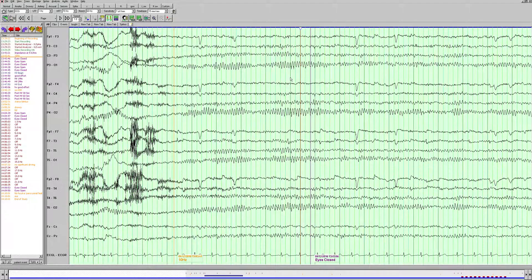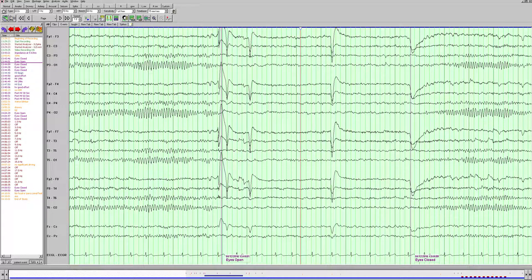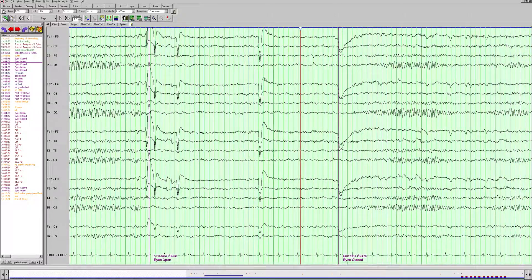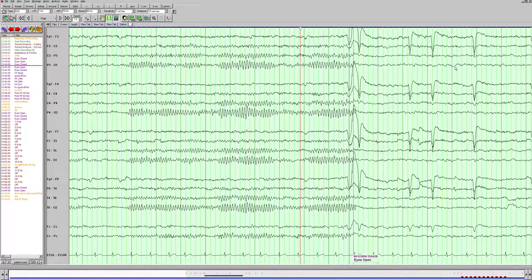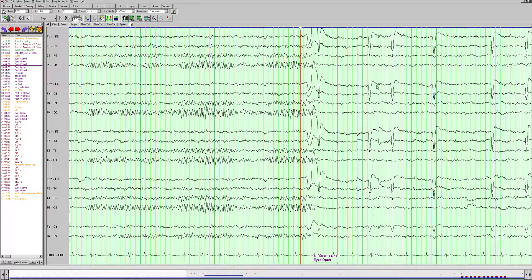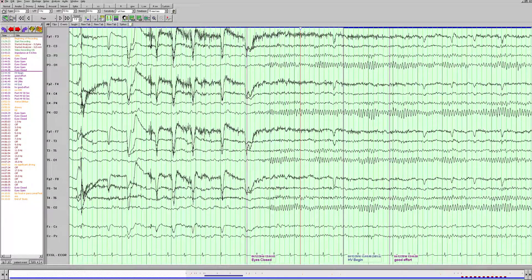The other thing we want to look at is the reactivity. Here's a beautiful example of our posterior dominant rhythm — we see the eyes opening, and we see attenuation of the background, meaning this patient's EEG is reactive to eye opening. We can see these eye blinks, and then the eyes close and our posterior dominant rhythm is back. We are able to see the deflections on the EEG because the eyes are charged — the cornea is positively charged, so when the patients blink, the eyeballs actually go back in the head and the electrodes pick up that charge.